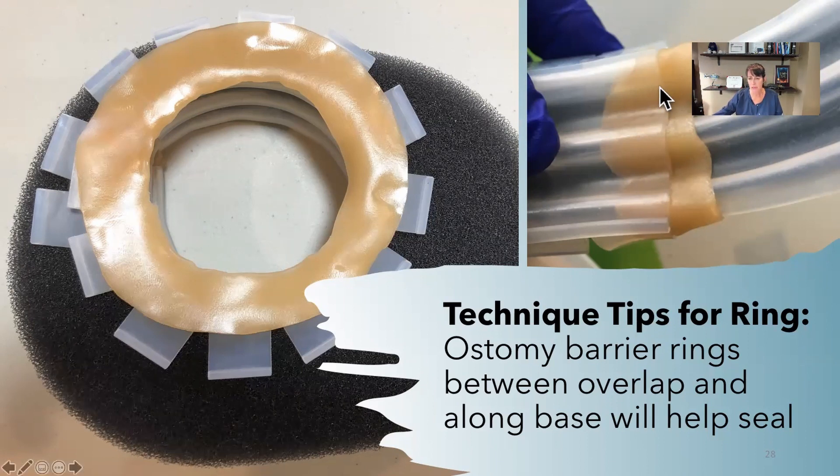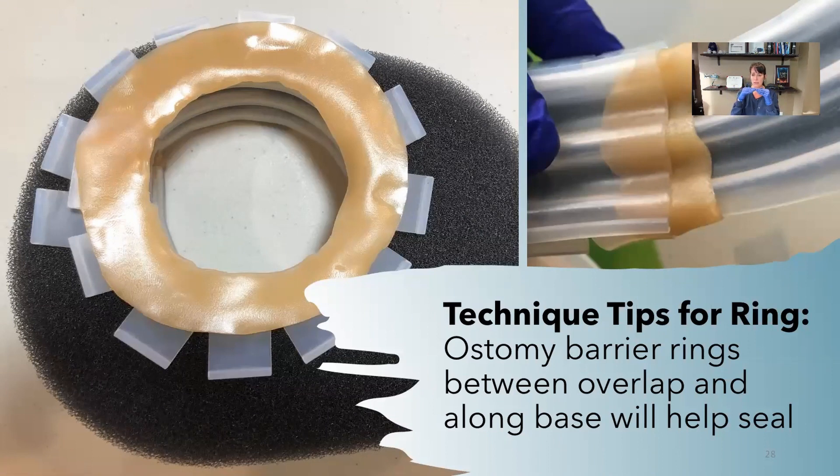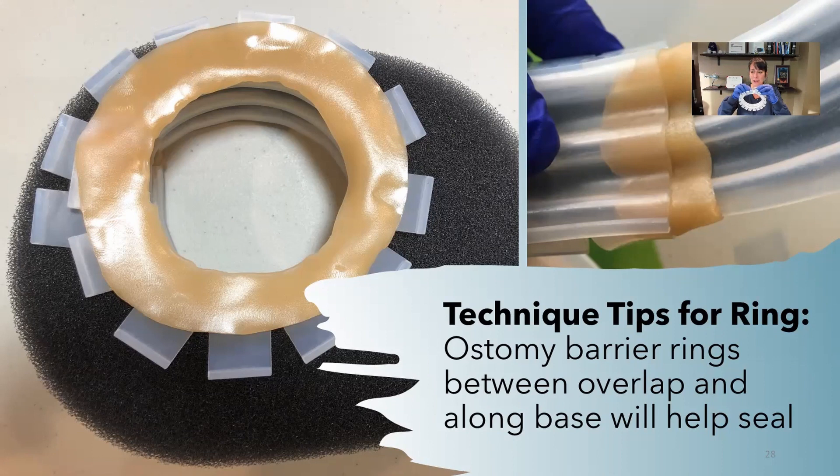This is probably the most important one right here is where it overlaps itself. You can't just bring it right up to itself like this. You actually have to have it overlap. On that overlap, you have to put that barrier ring. Otherwise, you'll never get a seal.